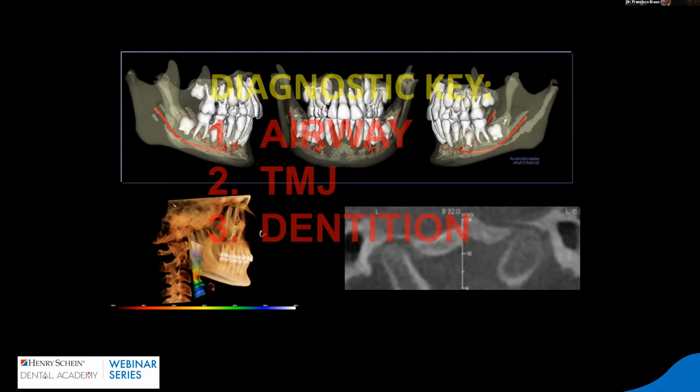Today, again, we have the ability to introduce the CBCT into the diagnosis and treatment plan of the aligners. Why is that important? Because sometimes we are moving teeth into places where we don't have bone, or doing movements that take the teeth out of the bone. I'm not saying that happens all the time, but maybe one out of 1,000 people. If we take radiographs and do follow-ups, comparing before and after, we're going to figure out that sometimes we don't have enough bone to move teeth.